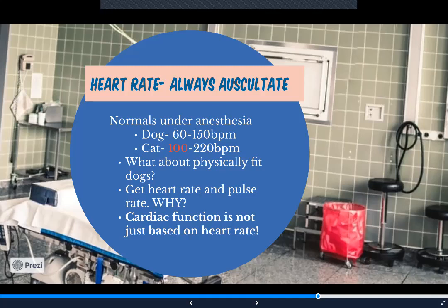Cats on here, I think in McKiernan's, a cat's heart rate can go to about 100. And for me, that's a little bit of an alert. So just keep that in mind. Granted, it could be more drug induced, but I'm thinking around the 120s is more in my comfort zone. That's why I had 100 on here, just to stay with McKiernan's to keep everything consistent.